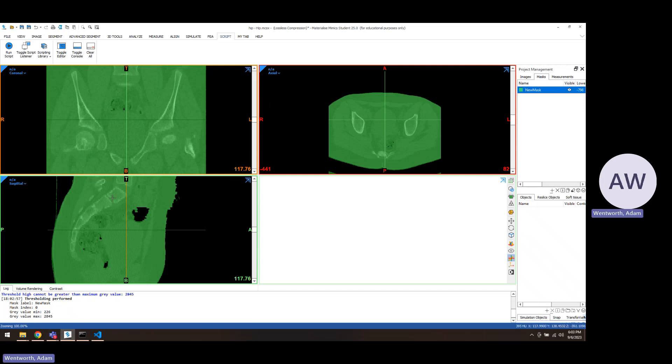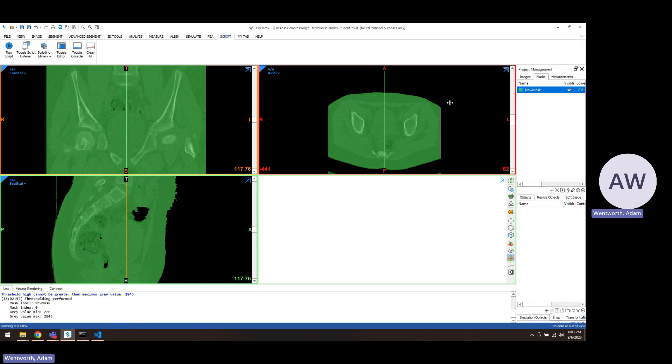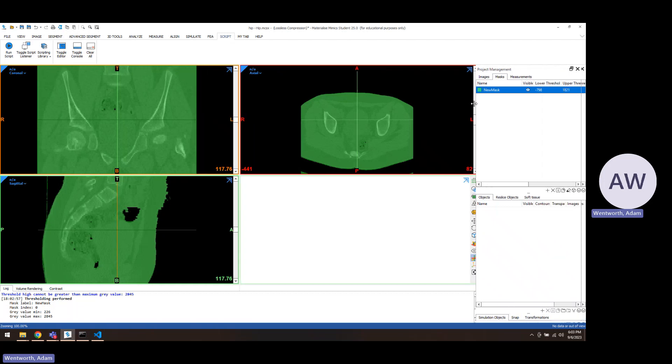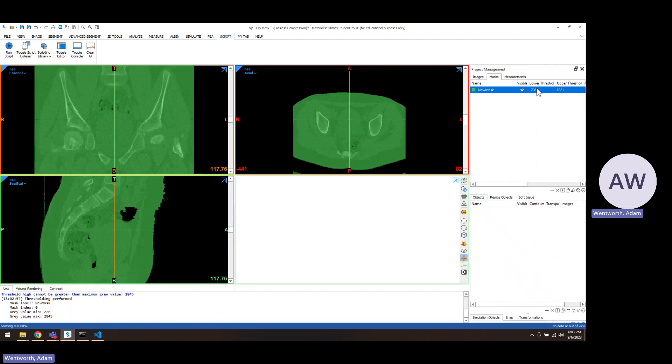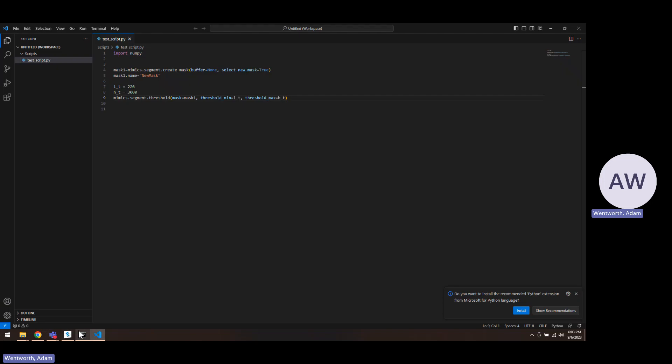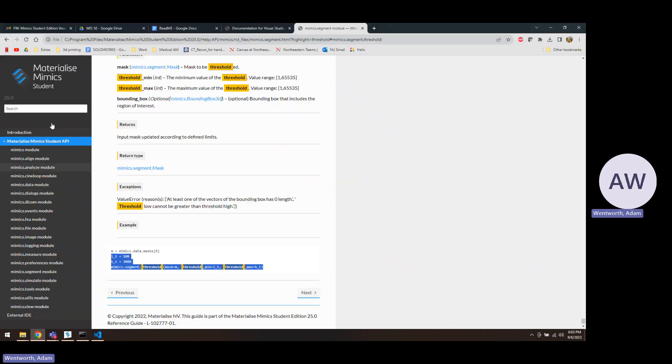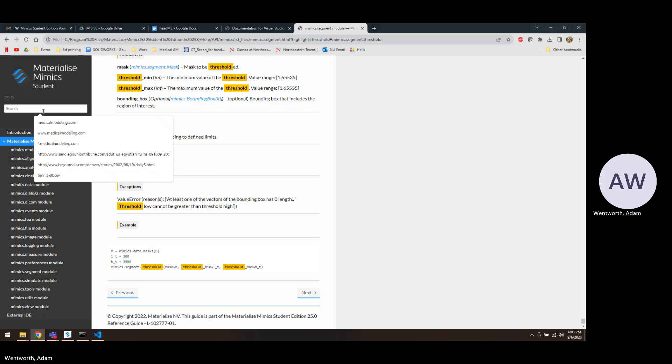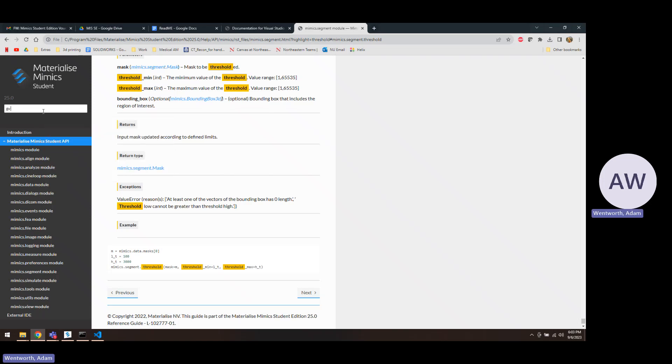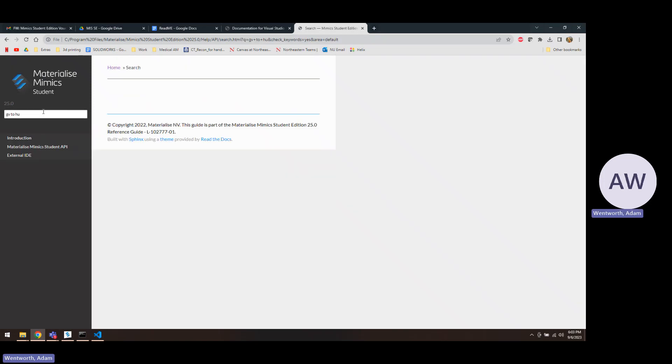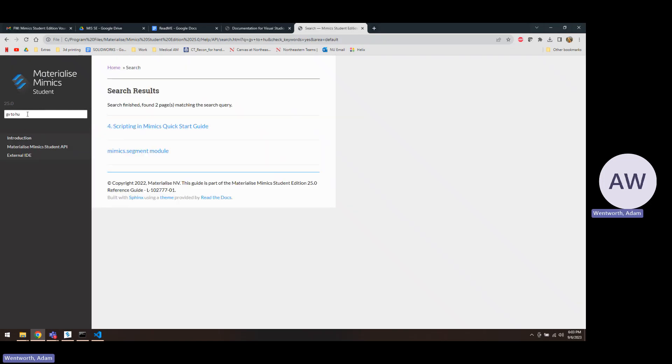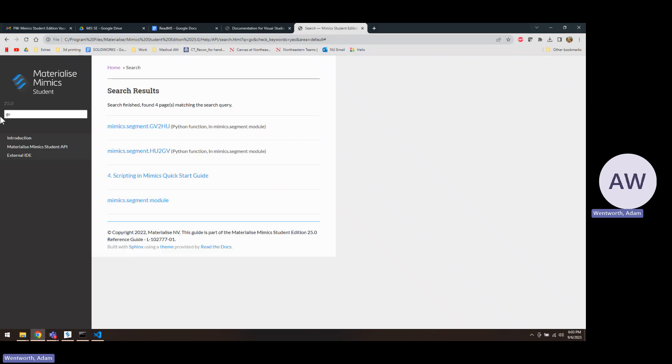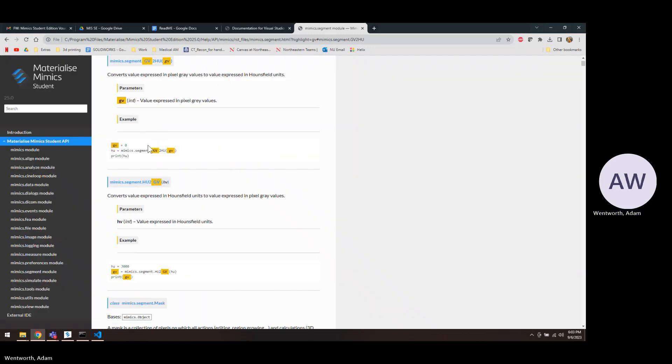All right, so it used a gray value here of 226, but we actually wanted a Hounsfield unit. So you can see why we would need to convert the gray value to Hounsfield units and use that instead. So we could look over here. GV2HU is the name of the code, and maybe we'll just type in GV so we can find it. Here, so here's a little conversion.